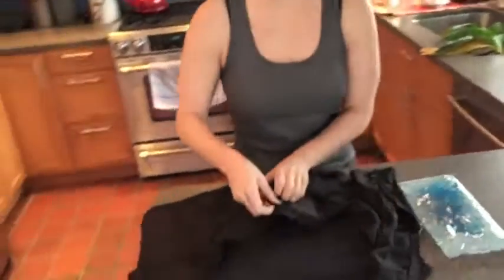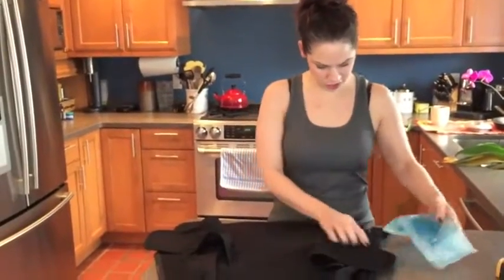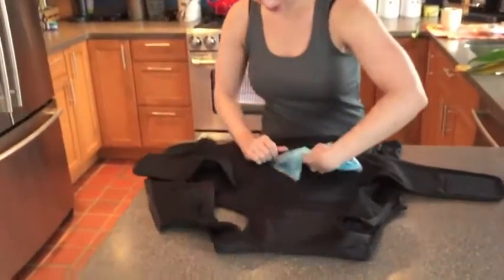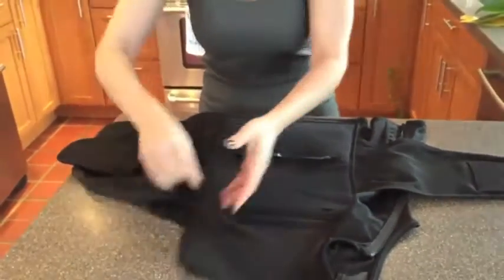Okay, so for me it's always low back pain, so I'm actually going to put this in the lower pocket. Put it in until you can't see the therapy pack anymore.